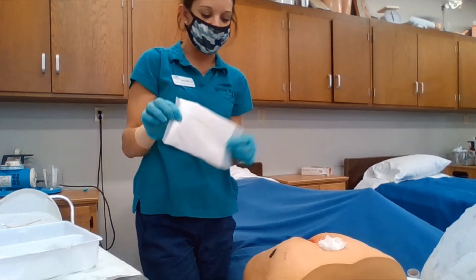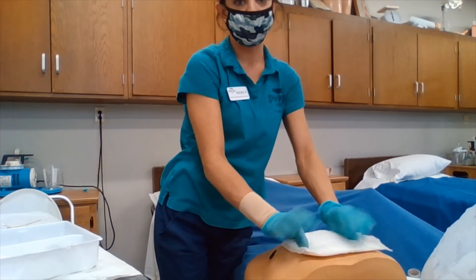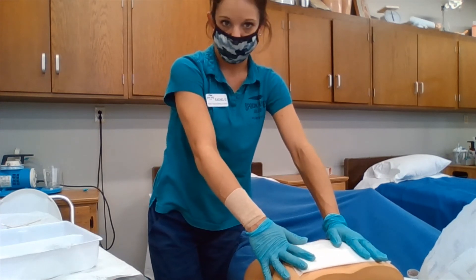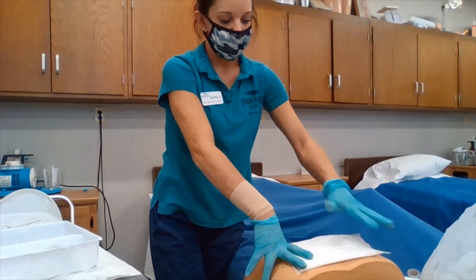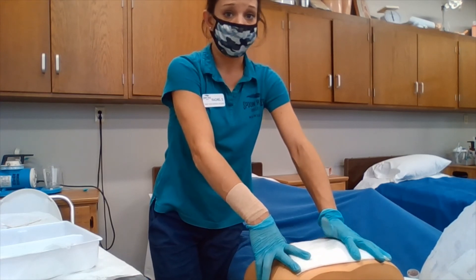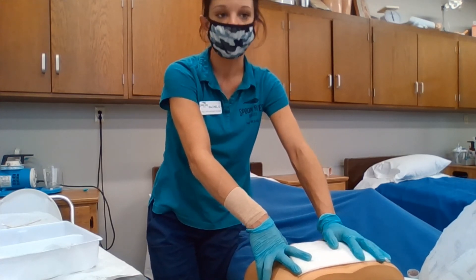We are then going to use the 4x4 gauze pad and place it over the wound. We will then secure it with our Montgomery straps. We are going to make sure that we are labeling it with the date, the time, and our initials.